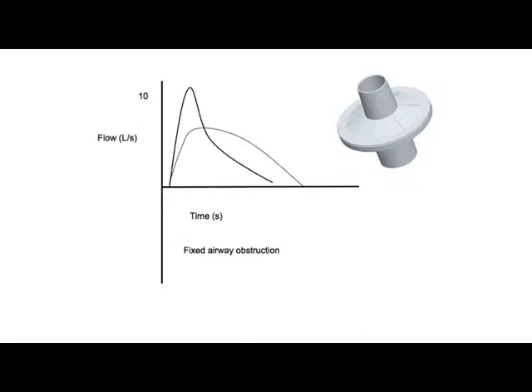What you're going to do is, if you imagine this mouthpiece, this filter, turn it towards you so you can see all the way through it, and you look at the inlet head-on. You're going to take a few pieces of tape. What we've done in the past that's really good is we've taken one and just blocked off half of the inlet, or two-thirds of the inlet, and then put the mouthpiece on over top to seal it in place. That way, you're really drastically decreasing the diameter of that airway.